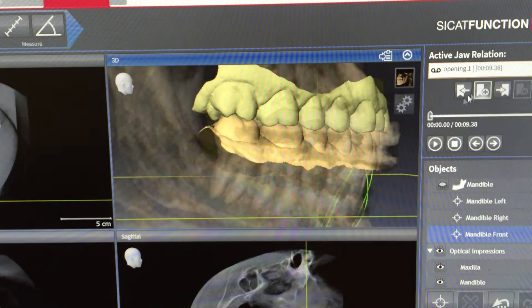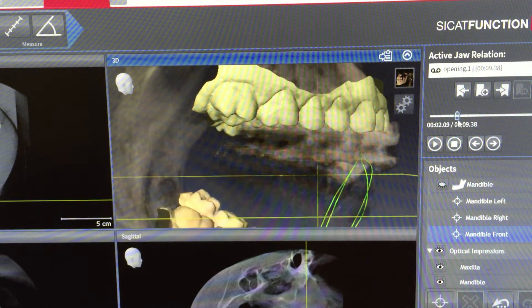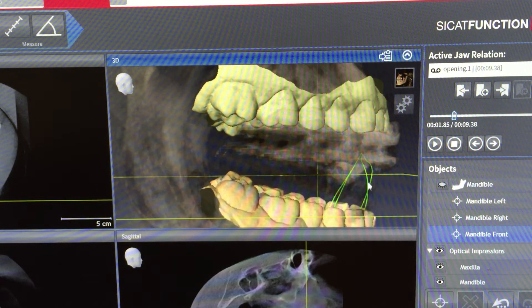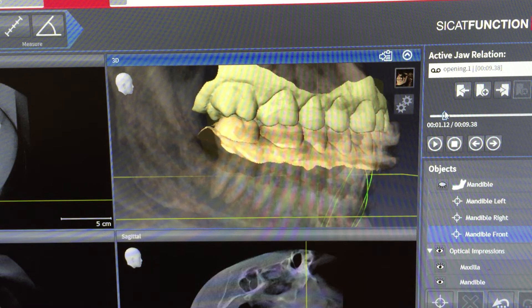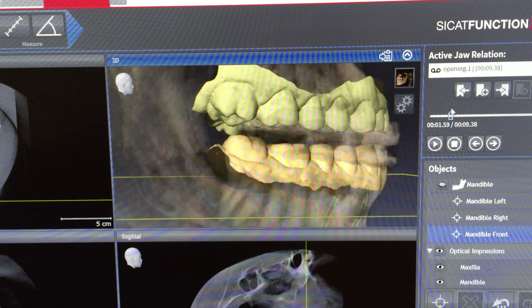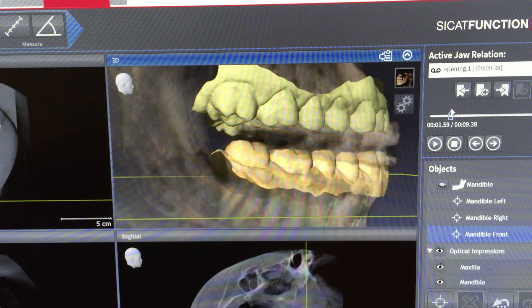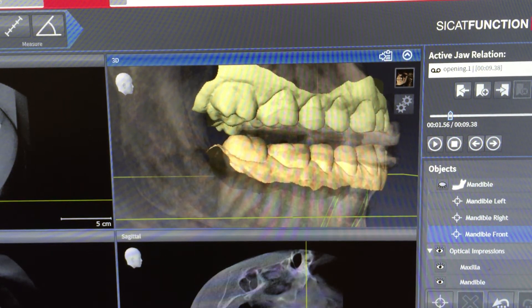I come back again to the same opening and closing and reach that position where the mandible is — this is the point I'm trying to achieve. This is the actual closure where everything is pushed back. So I'm trying to determine the position right before that compression occurs, confirming this is the proper trajectory before all the compression.